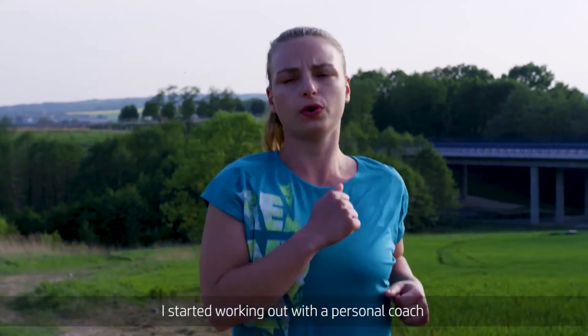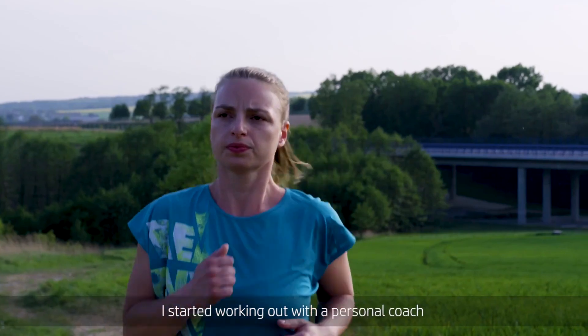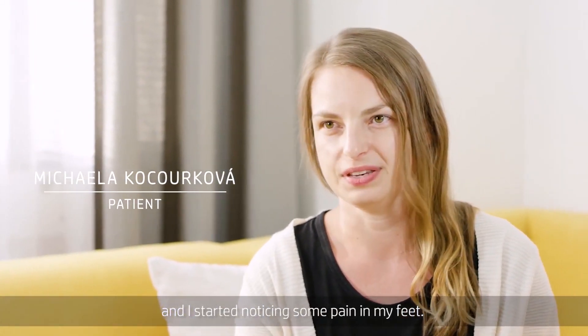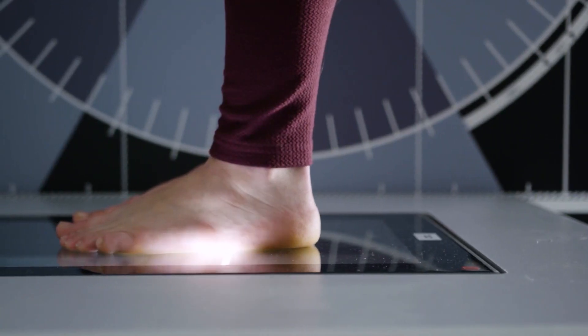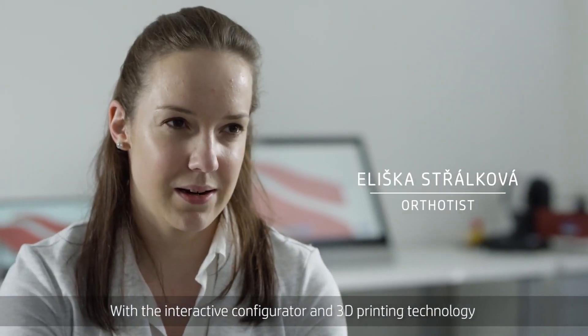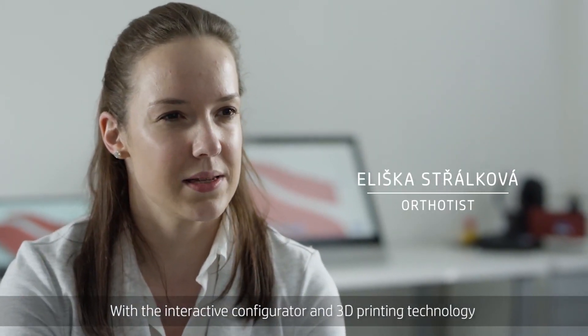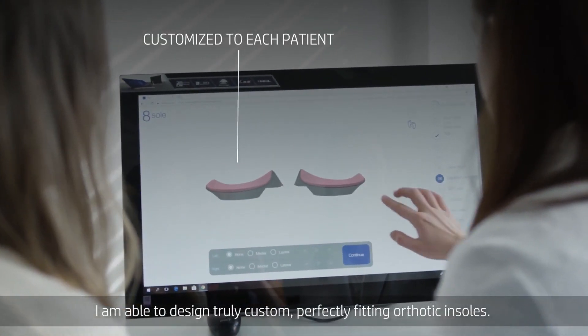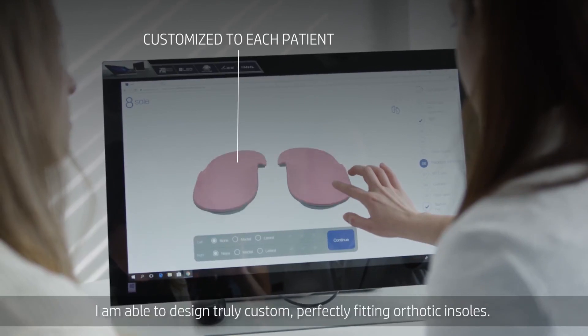I started working out with a personal coach and I started noticing some pain in my feet. With an interactive configurator and 3D printing technology, I am able to design truly custom, perfectly fitting orthotic insoles.